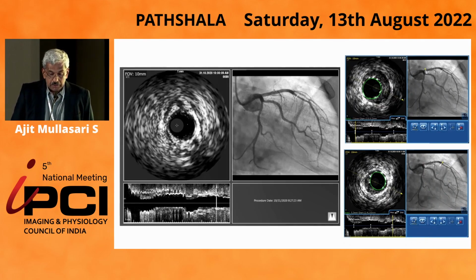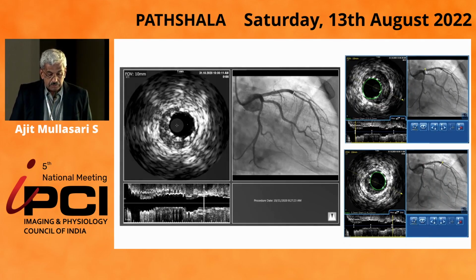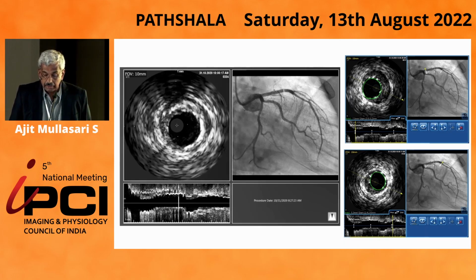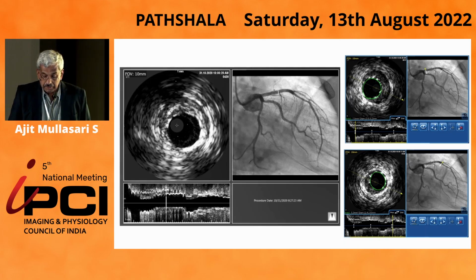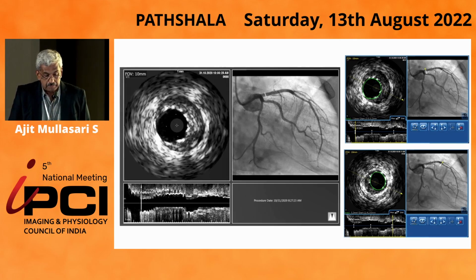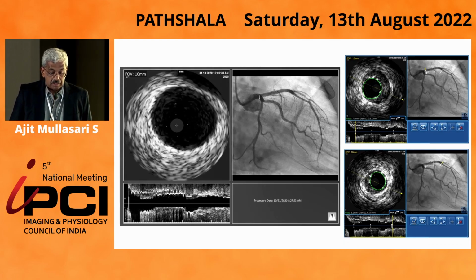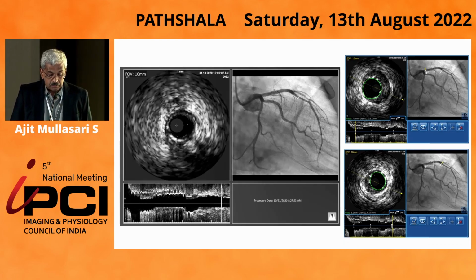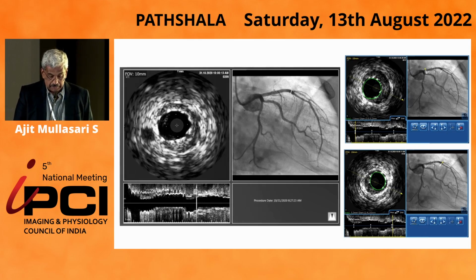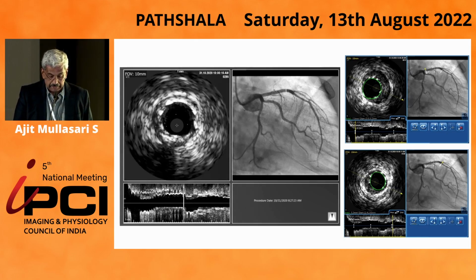So this is the post picture, and you can see the bridge, and then it comes through. The distal stent looks reasonably well deployed. The areas distally is about 5.3 and proximally is about 7.5. There's a little miss of the ostium of the LAD, so we didn't go very far up. We thought that this was fine. We got good lumens. We didn't want to create a problem in the ostium of the LAD.